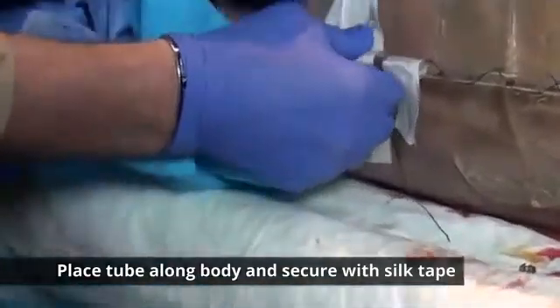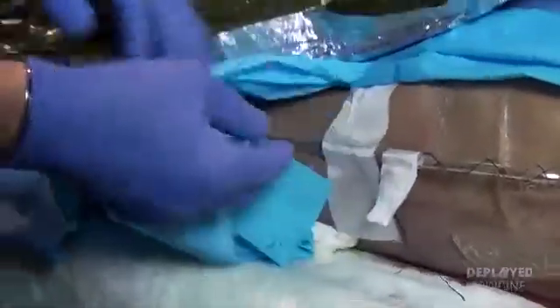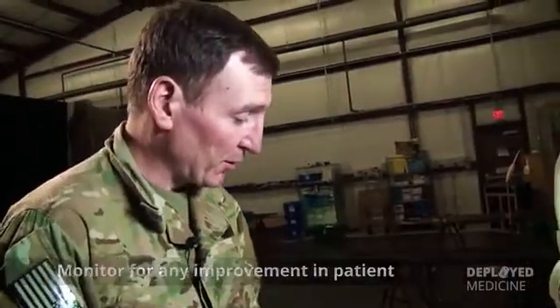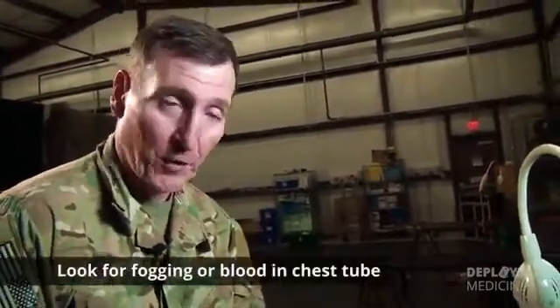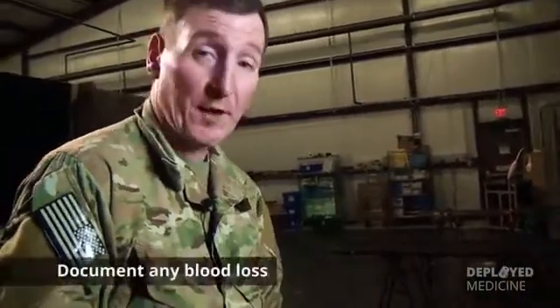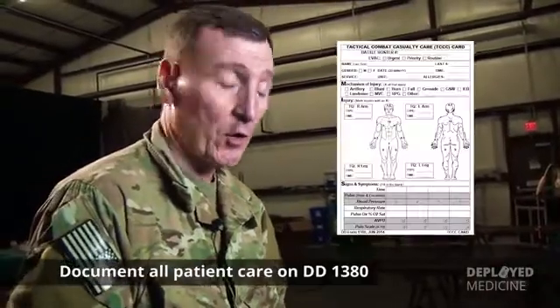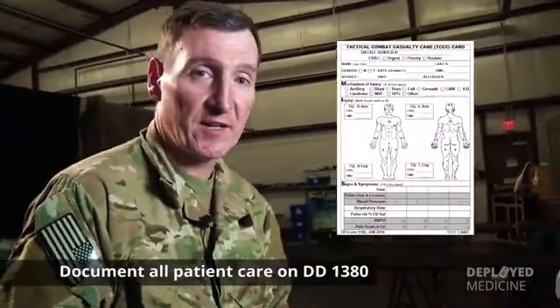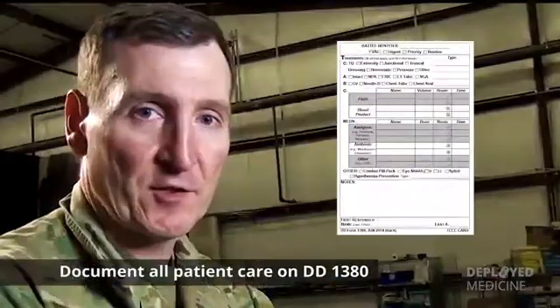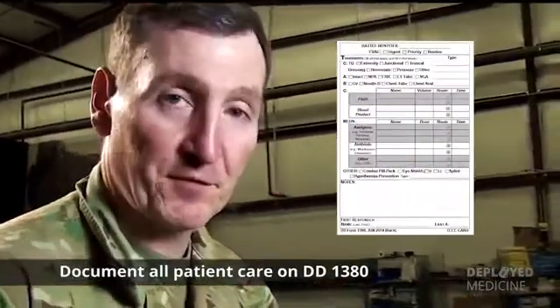So once you finally have your chest tube in place, go ahead and monitor for any improvement in your patient. Continue to look for any fogging or blood in your chest tube. You're going to document any blood loss, and you're going to document the chest tube and all your care on a DD 1380 to ensure that that information is passed up the chain to the receiving facility.